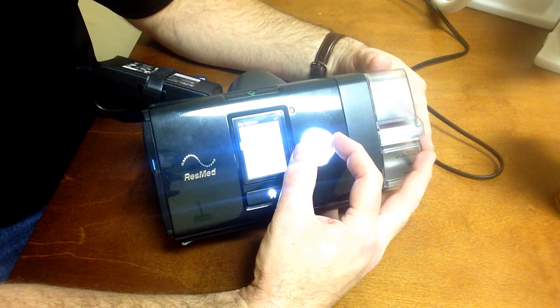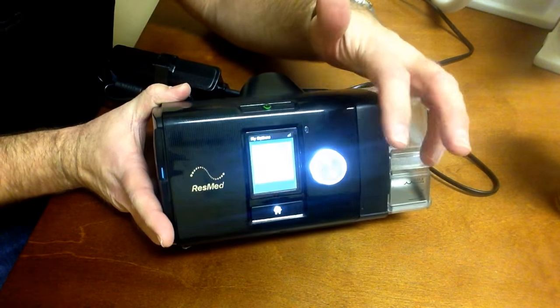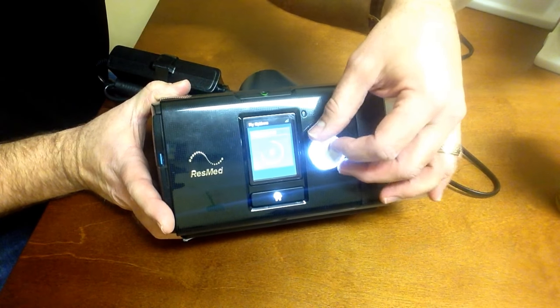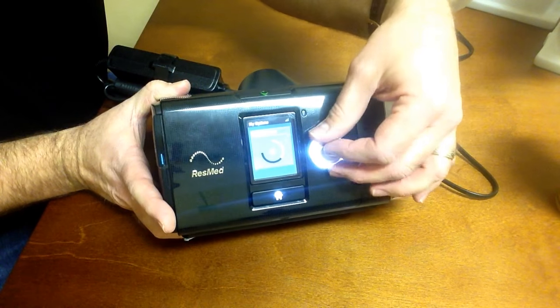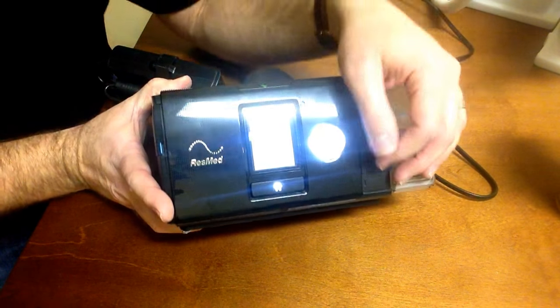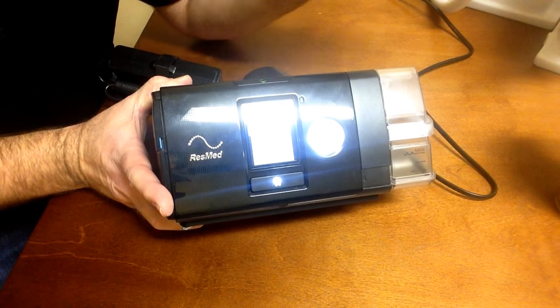Right after ramp time, you'll notice humidity level. Same process — click the push dial to select your humidity level, then turn the push dial to increase or lower that setting, and click the push dial again to set it in. Now you've set your ramp and your humidity level, so you're good to go.